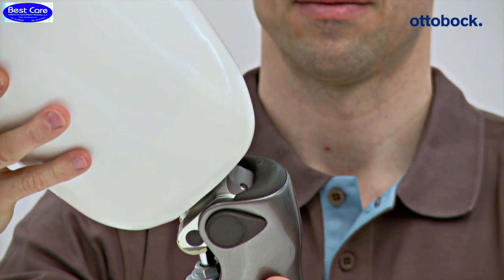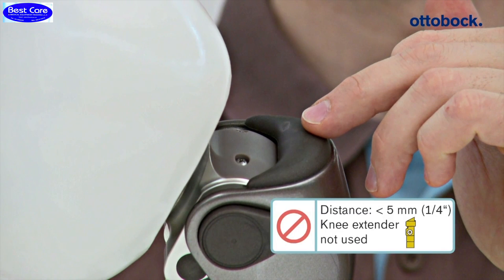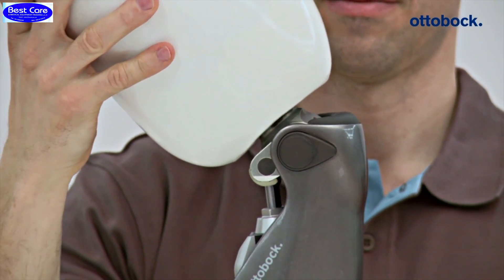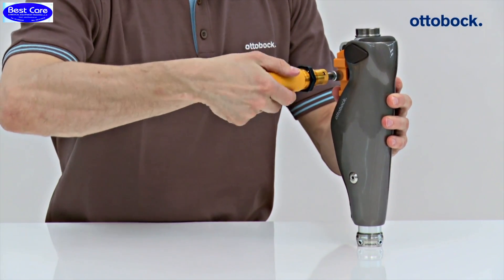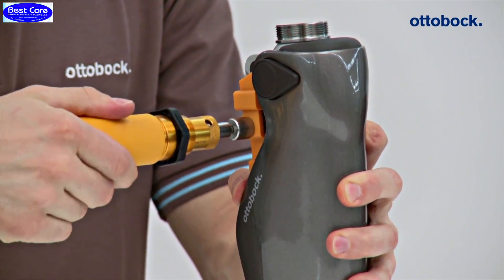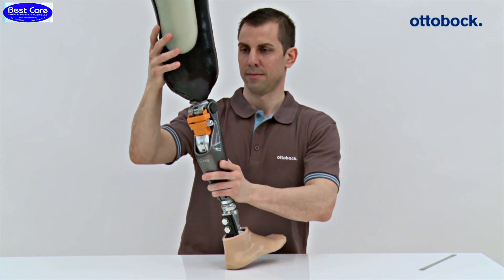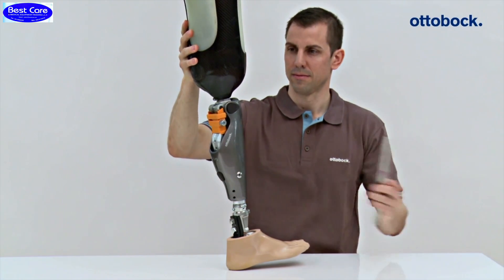If, as in this case, the specified minimum distance is not maintained, readjustment of the distal socket area is required at a minimum. The knee extender must be applied during bench alignment of the C-Leg 4th to simulate a loaded prosthesis. There must be at least 5 mm of space between the socket and main electronics even when the knee extender is applied.